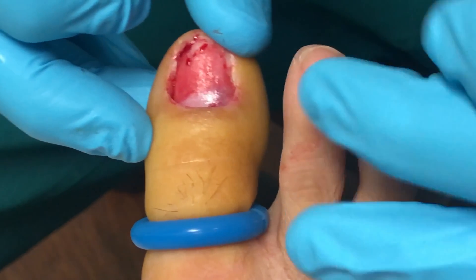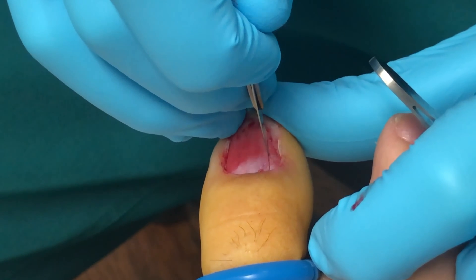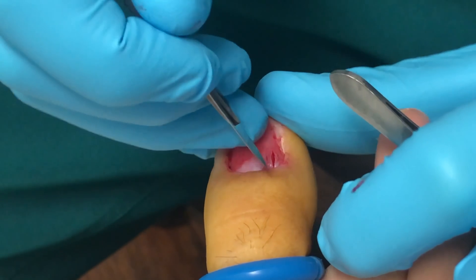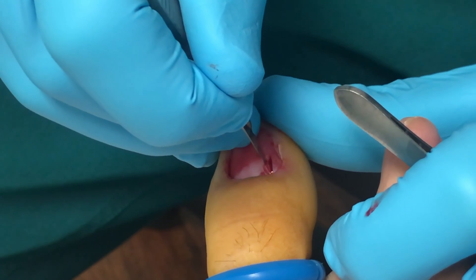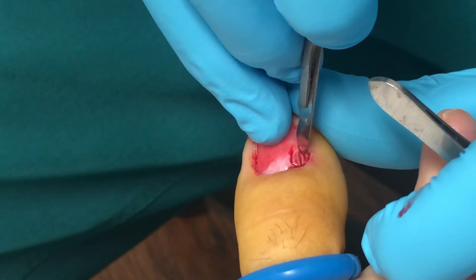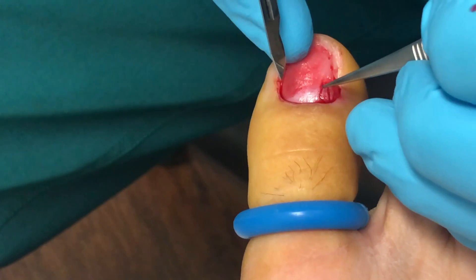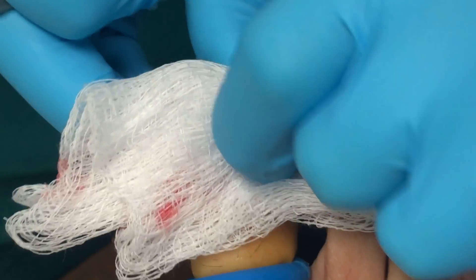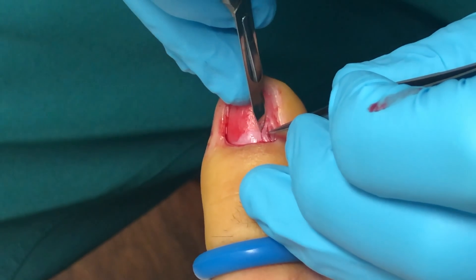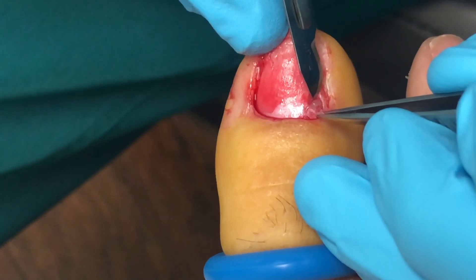So again, that's kind of right here what we're looking at. What I want to do first is just kind of do a little stab incision over it so we can see what we've got. Now we're going to kind of do a football shape around it — micro surgery here. You can see there's a little bulbous area right there.